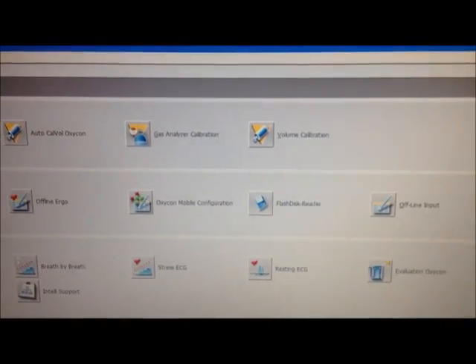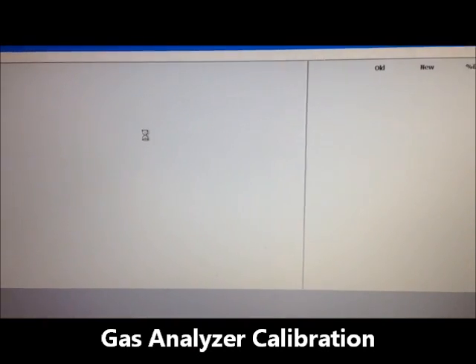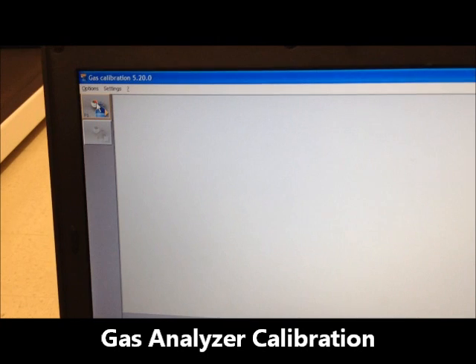And then for gas calibration we're going to go to gas analyzer calibration. You'll see a similar setup with the play button illuminated over here. To do gas calibration go ahead and click on the play button.